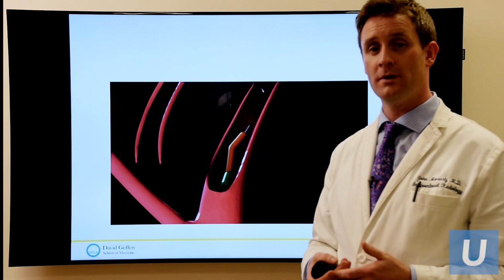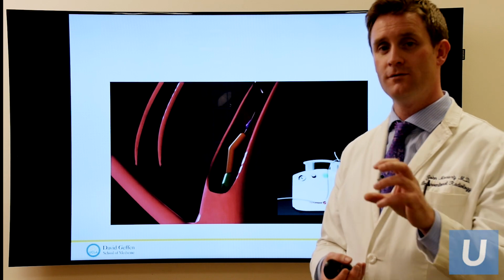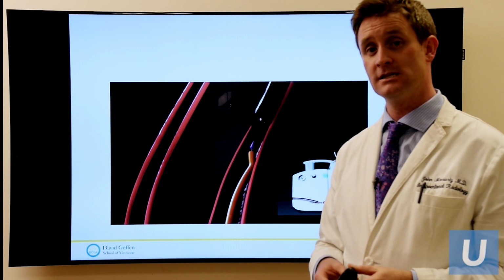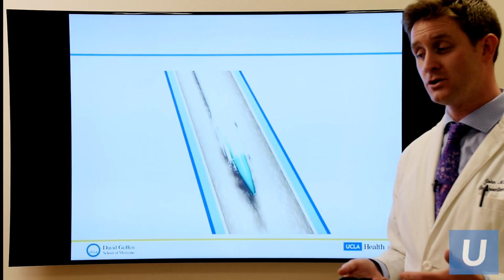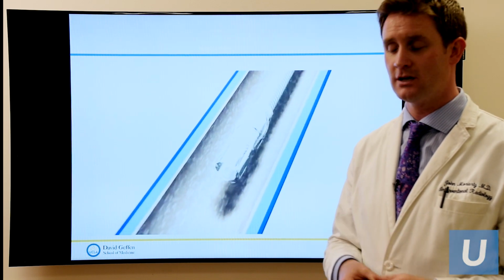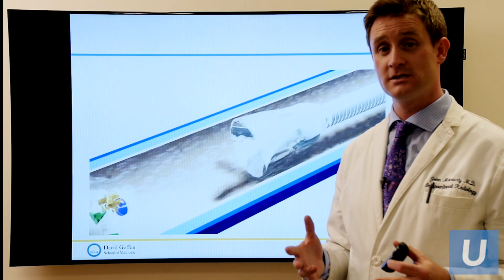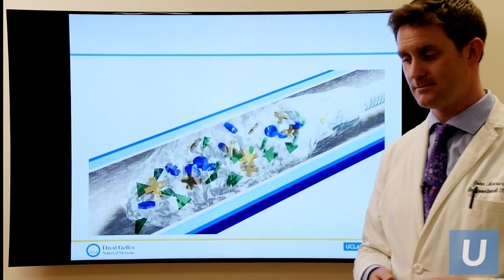Other devices work more by suction. They're able to get the clot directly, suck at it, remove it from the vein and bring it outside of the body in a rapid way. We either have small caliber devices for use in veins below the hip or below the knee, or indeed larger ones if you've got one of these big clots in the belly, in the pelvis, or in the heart and lungs itself. And we've developed quite an experience, our group, over the last few years in using these. So we've got a large and diverse ability and practice that we try and tailor particularly to your needs.